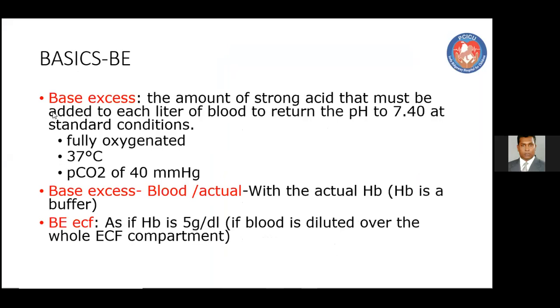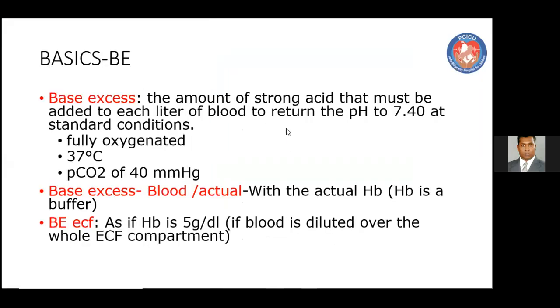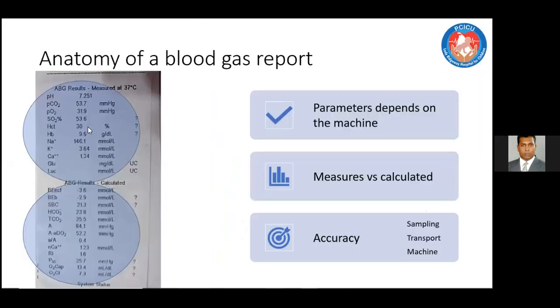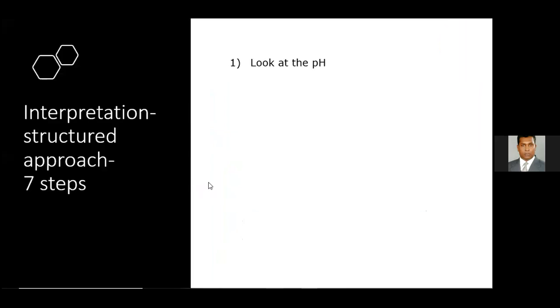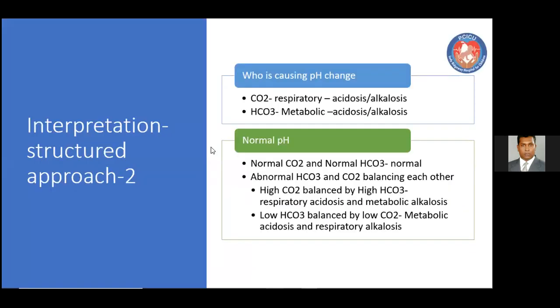So just to tell you certain things about this base excess and the base deficit and the bicarbonate. If you look at the blood gas report here, you can see base excess is expressed as base excess ECF and base excess blood, and bicarbonate is expressed as standard bicarbonate. SBC is standard bicarbonate and actual bicarbonate. So let's look into what these terms actually tell you.